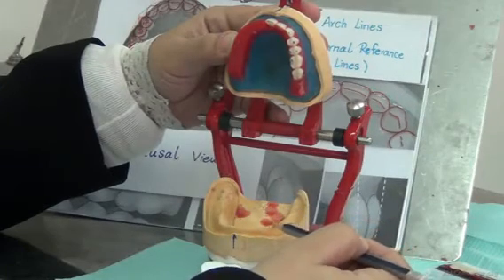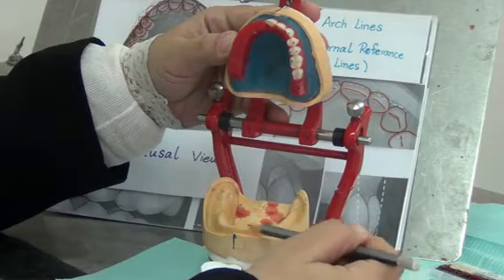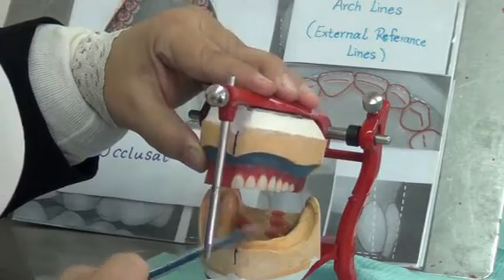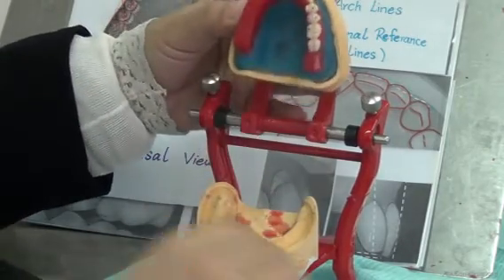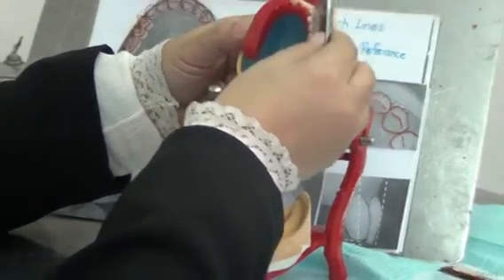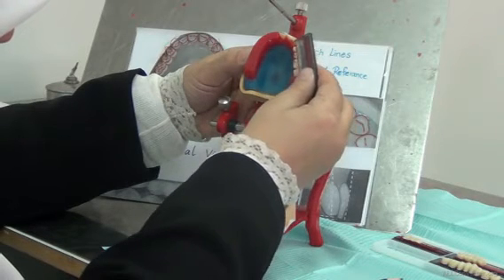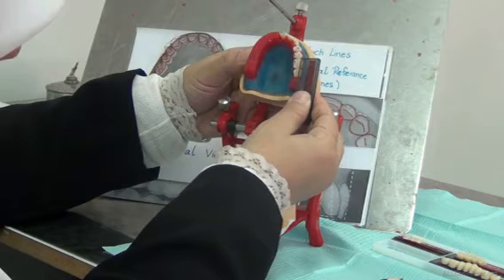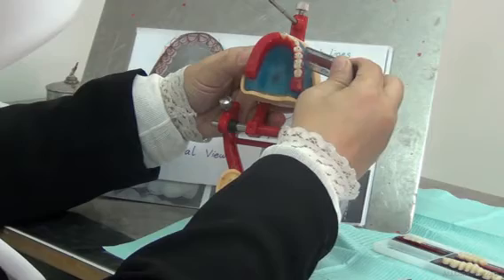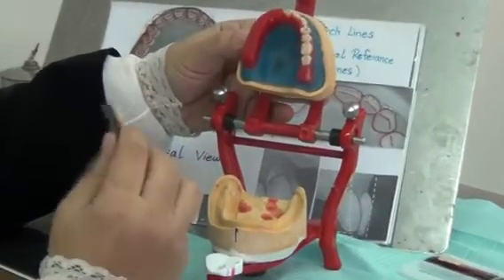So this is the crest line. If I just let the pencil run over the crest, this is the crest line. So the palatal cusps of the upper are over this line. We also have other reference lines, the lateral lines. So we have the arch line in the anterior area, we have the tips of the canine, premolar, and molar on one line, which we call the mid-buccal line, and then we have the posterior line where we have the cusps of the molar, mesial and distal of the second molar, all in one line, so this is another line. So these are called reference lines.